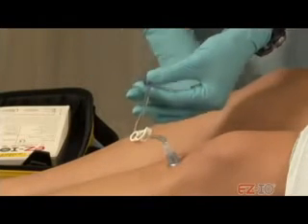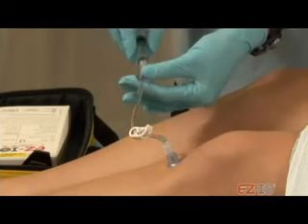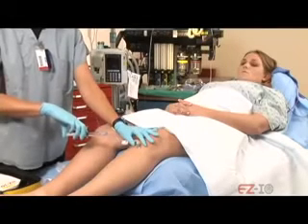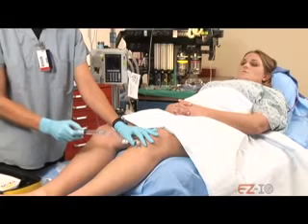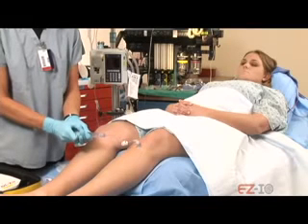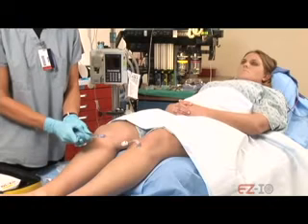Okay. Now again, we're just going to go slowly here. Doing okay? Mm-hmm. Still doing okay? What's your pain level on a scale of 1 to 10?